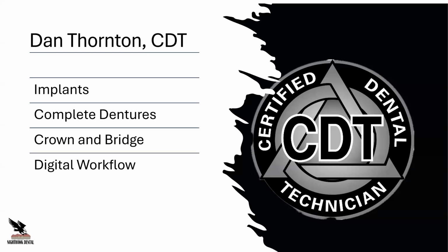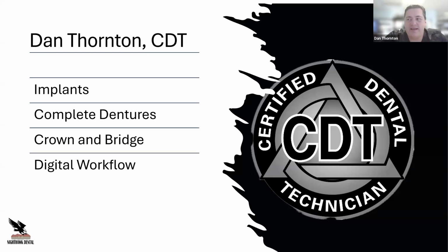We have another question, Dan, and it says, how long does a denture conversion typically take? If you're talking about a traditional denture conversion, from when it comes out of the patient's mouth to when you're actually getting it done, if you're using acrylic, it takes a little bit longer because it has to set up in hot water, a pressure pot, be cut back, and everything else. If you're using a dual cure material, it goes faster as long as it's bonding to your denture. You have to make sure that if it's a printed denture, the material will bond to that printed denture. If it's a traditional denture, you normally won't have a problem with the bond if you're using a certain product. I myself found that Stellar works very well on a printed denture or a traditional denture. It bonds very well to it.